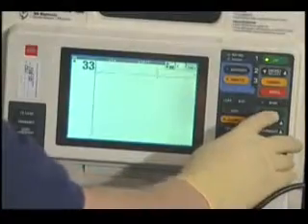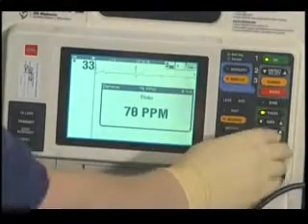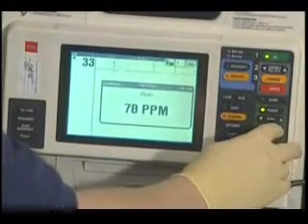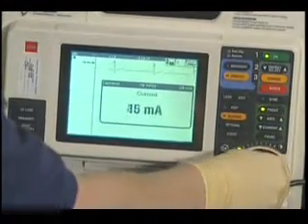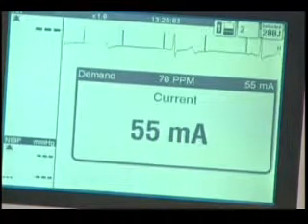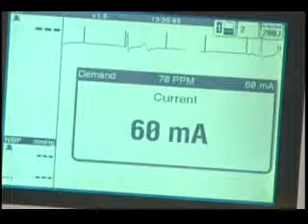Turn the pacemaker on and adjust the rate as indicated in your local protocol. Often this will be 70 to 80 beats per minute. Observe the monitor for pacing spikes at the rate you've selected. Then adjust the energy level until capture is observed.